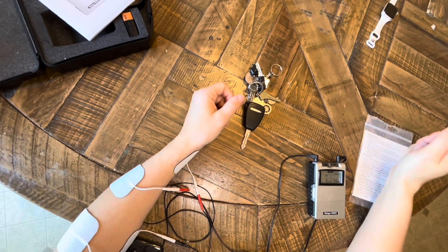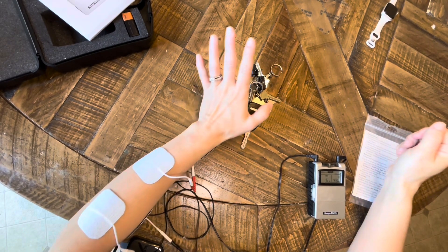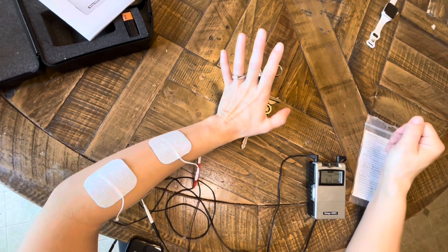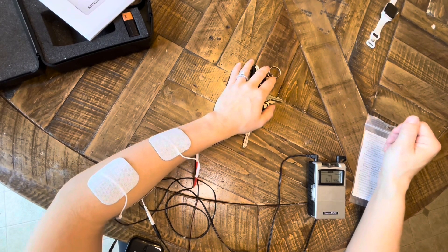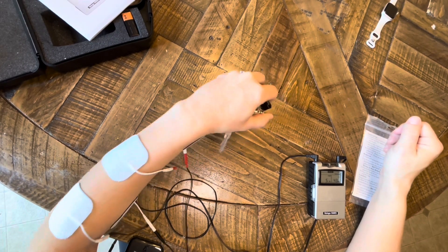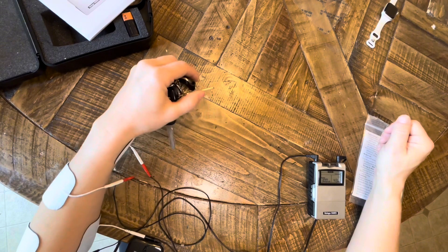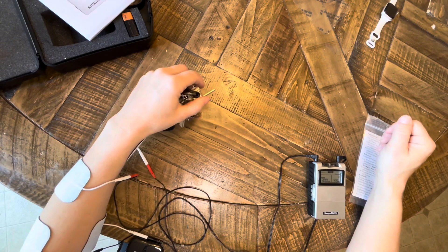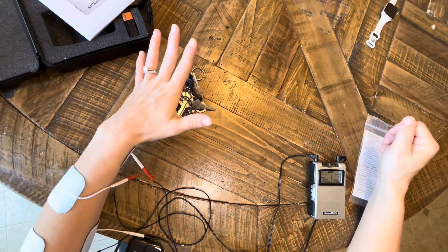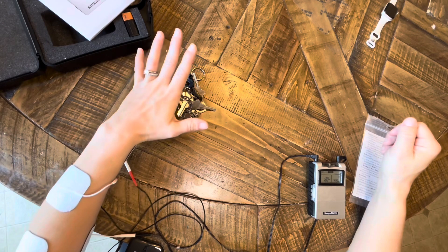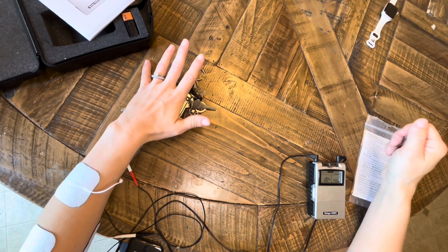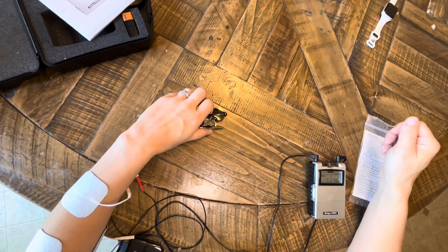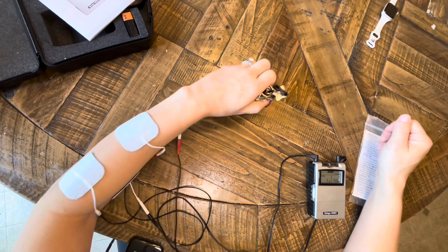So when my extensors are on, that's when I'm going to prepare to grasp the keys. And then when my flexors are on, that's when I'm going to pick my keys up. Extensors back on, that's when I'm going to release the keys and then bring it back in preparation. Flexors pick them back up.